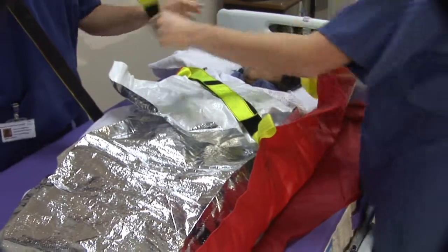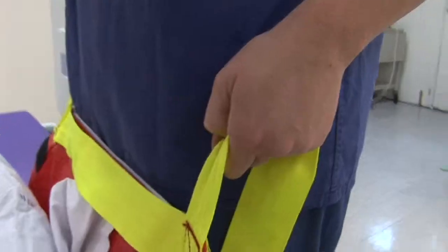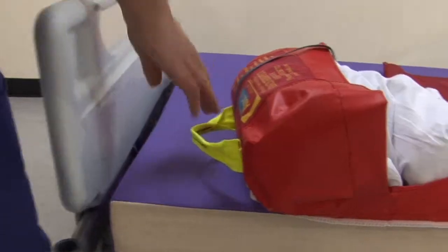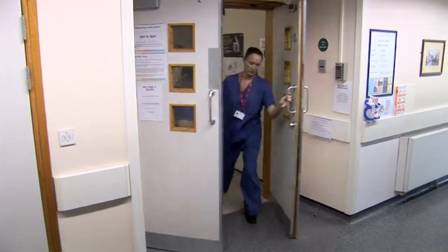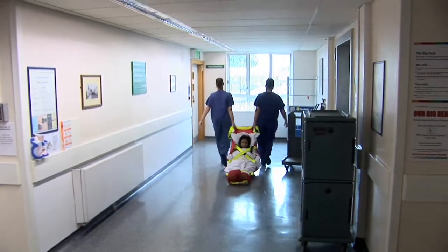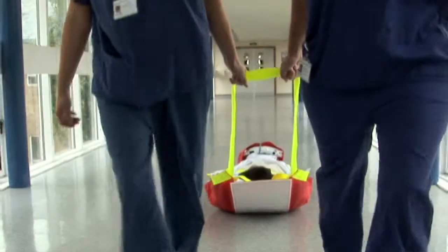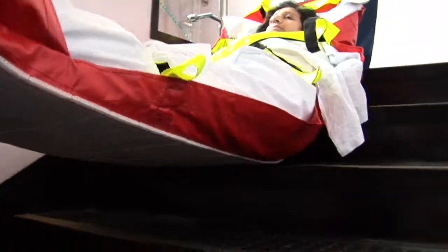Velcro straps restrain the patient while a foot pocket secures the feet. Various handles allow staff to safely evacuate patients from hazardous situations. The material enables the rescuer to move the patient to safety with relative ease as there is minimal friction. The rigid properties of the board remove any concussion while in transit and provide added protection to the patient.